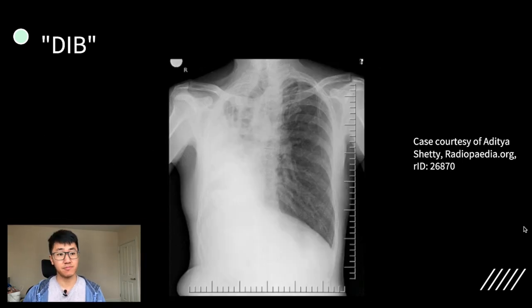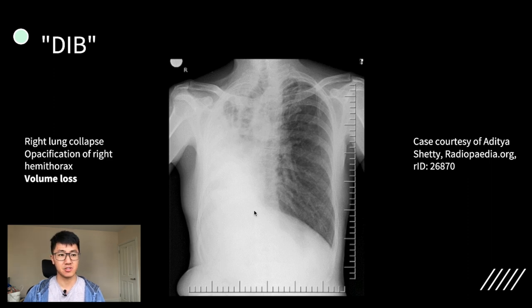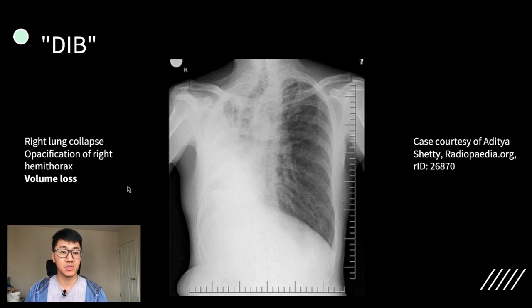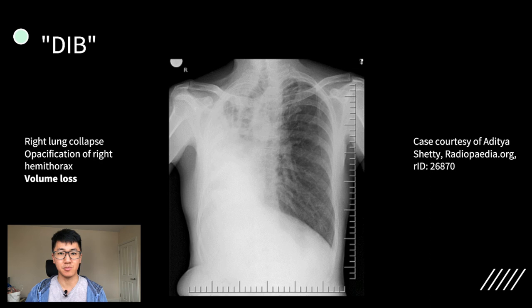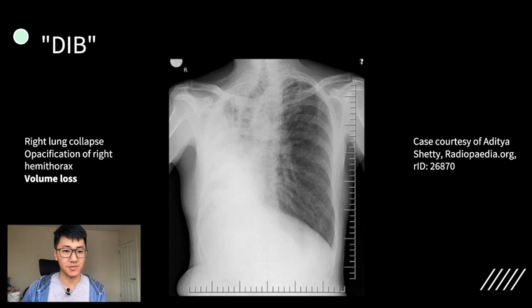Now have a look at this one. So this is quite a tough one because you have widespread opacification of the right hemithorax. Your initial thoughts might be that this could either be a very large effusion or a very large collapse. The way to tell is to look at the associated features. In this case, the mediastinum is very severely pulled towards the site of the abnormality, and that's consistent with volume loss, which would be a sign of collapse. So this is right lung collapse rather than a large right pleural effusion.